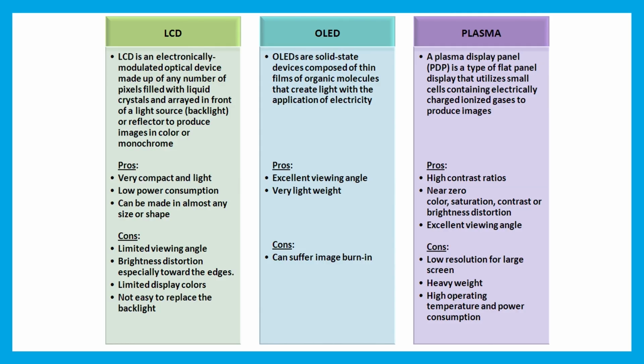Again, this next-to-last slide is just showing you the difference between an LCD monitor, an OLED, so this would be an LED monitor, and plasma. And it's really showing you the pros and the cons to each of them, and why we end up using an LCD as opposed to some of these others. The LED is actually up and coming, but plasma will probably not be used in radiology for a while just because it's too expensive.